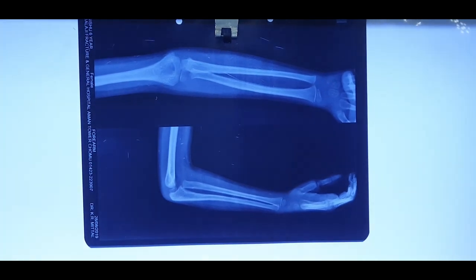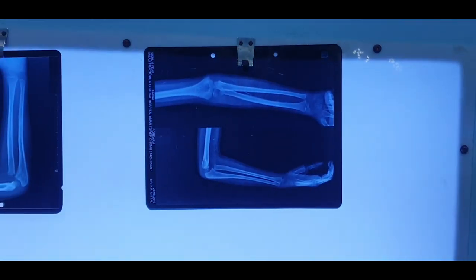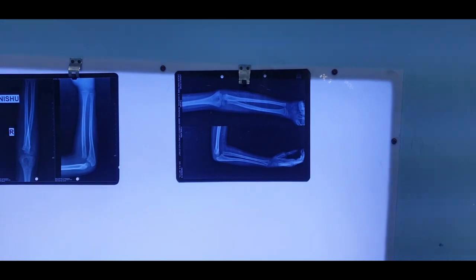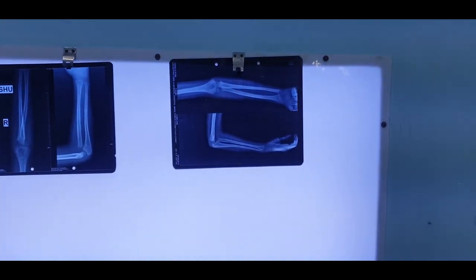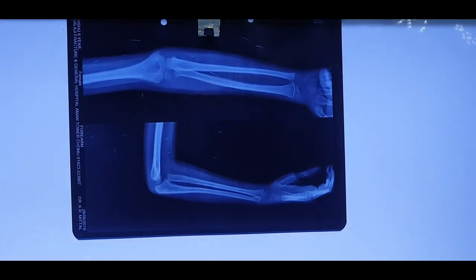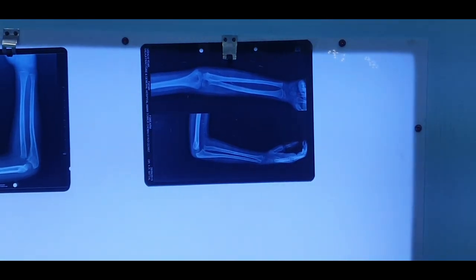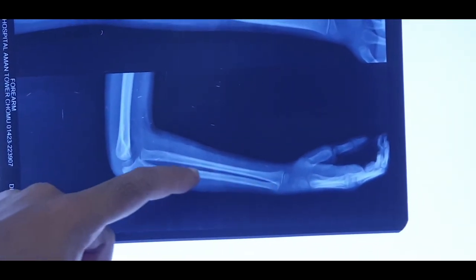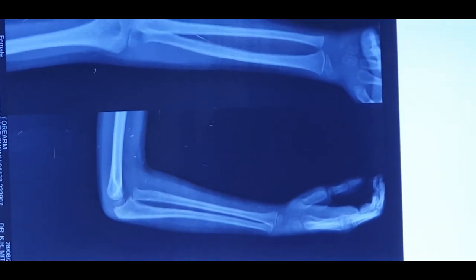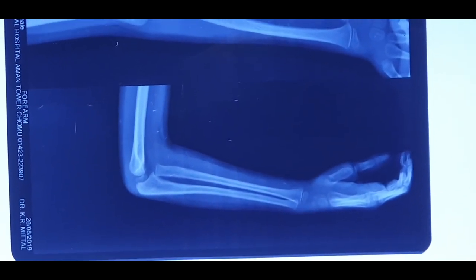Normally you see this in Monteggia fracture. However, on this occasion, there is no fracture line. The consultant who saw this patient initially failed to recognize this. She is now 3 weeks down the line complaining of pain and inability to flex past 90 degrees. If you look at the ulna, there is a clear bowing of the ulna. This is called plastic deformation of the ulna.